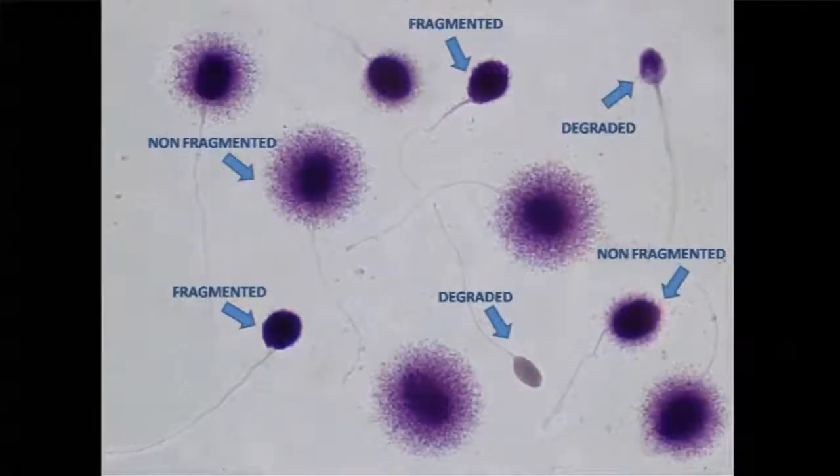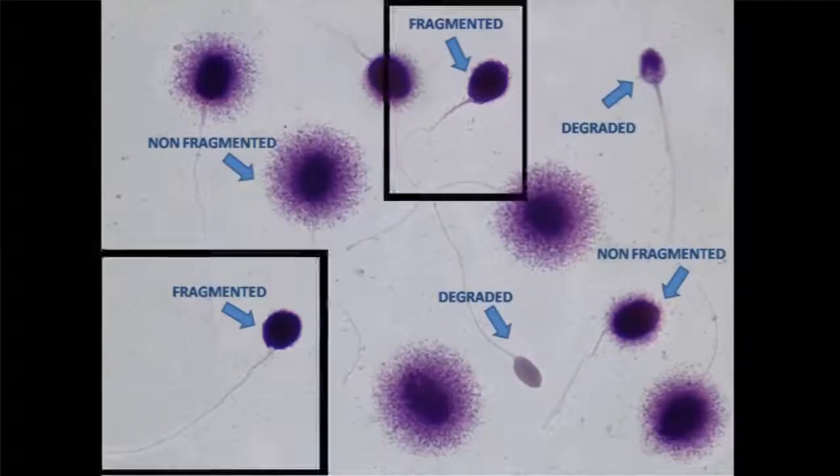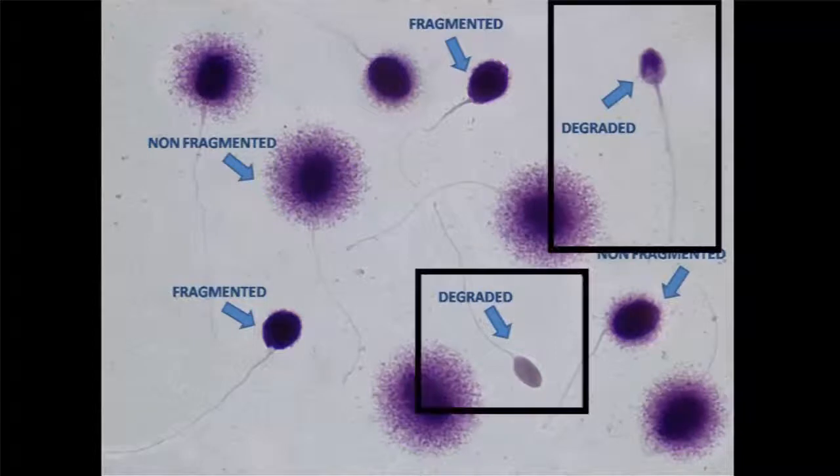Sperm cells with a small halo are considered fragmented. Those that are lightly stained and have a damaged membrane are considered degraded. Degraded cells are also counted as fragmented.